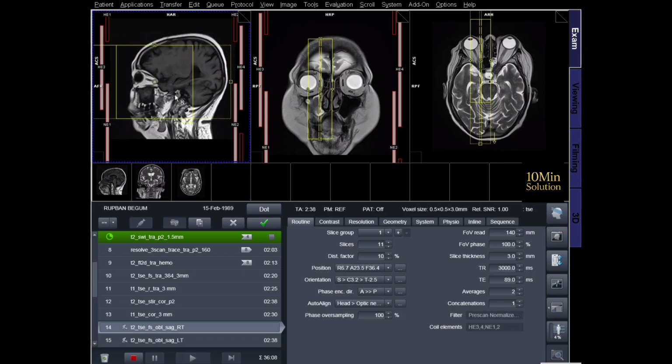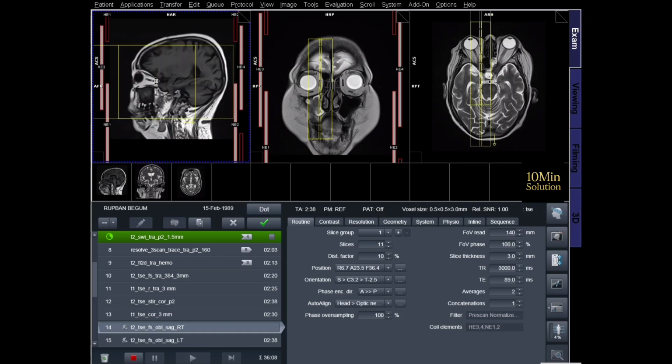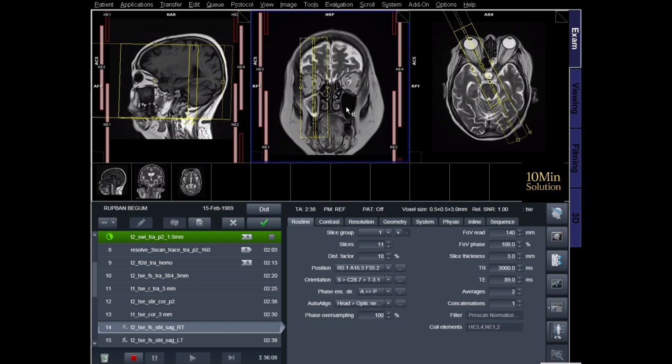Localizer or scout imaging. Before acquiring the main sequences, a three-plane localizer scan is performed. This includes axial, sagittal, and coronal scout images, which help determine the exact anatomical position of the orbit. These images are used as a reference for planning the diagnostic sequences.